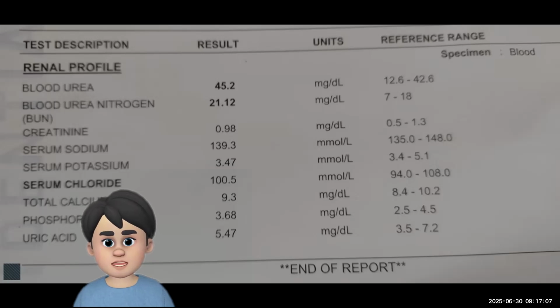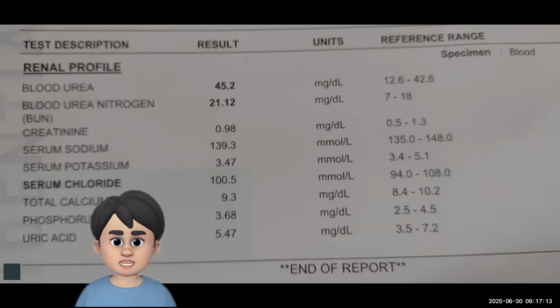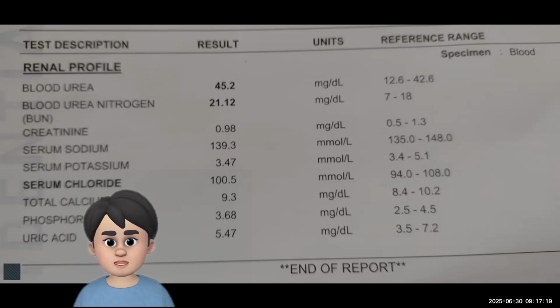So this is interesting. The patient did not have diabetes and sugar problem, that means hyperglycemia and cholesterol problems. So this is the report. Okay, we'll get back to the report.